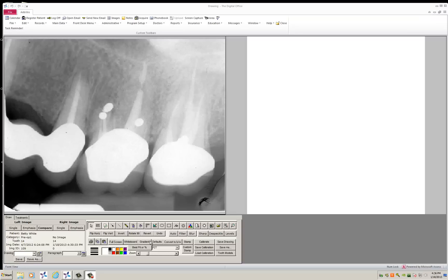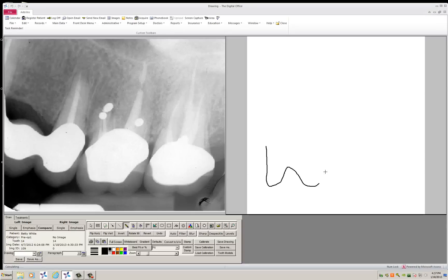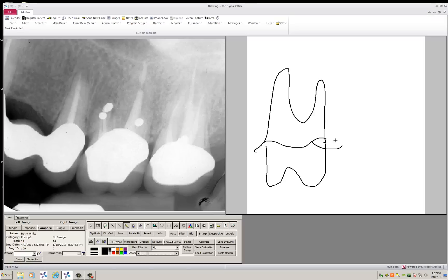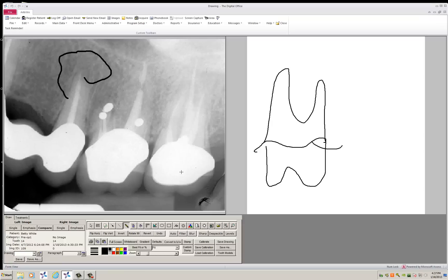Now usually you just pick one of the drawing tools, pick your color and go ahead and draw for the patient either here on the canvas or you can also draw on the radiograph itself. But occasionally, you'll actually want to have a predefined drawing.